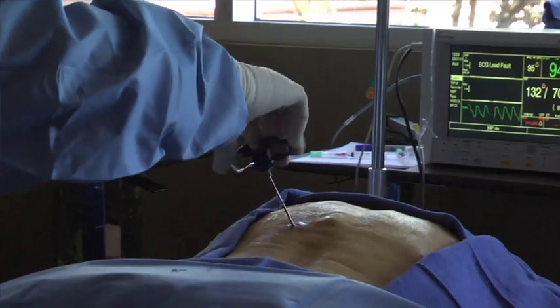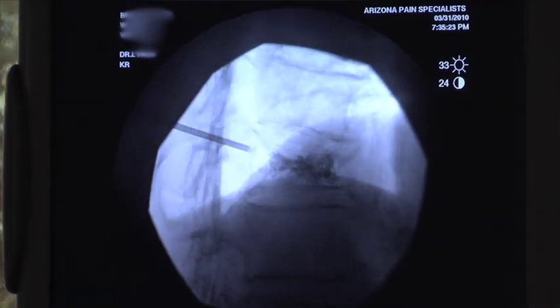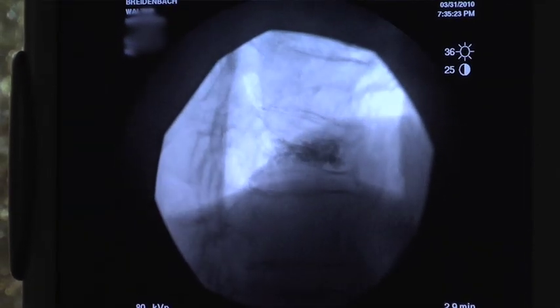Typically patients feel relief within hours of the procedure. The trocar is then removed. Special care is taken not to leak the cement outside of the bone and a small band-aid is placed over the 3mm incision site.